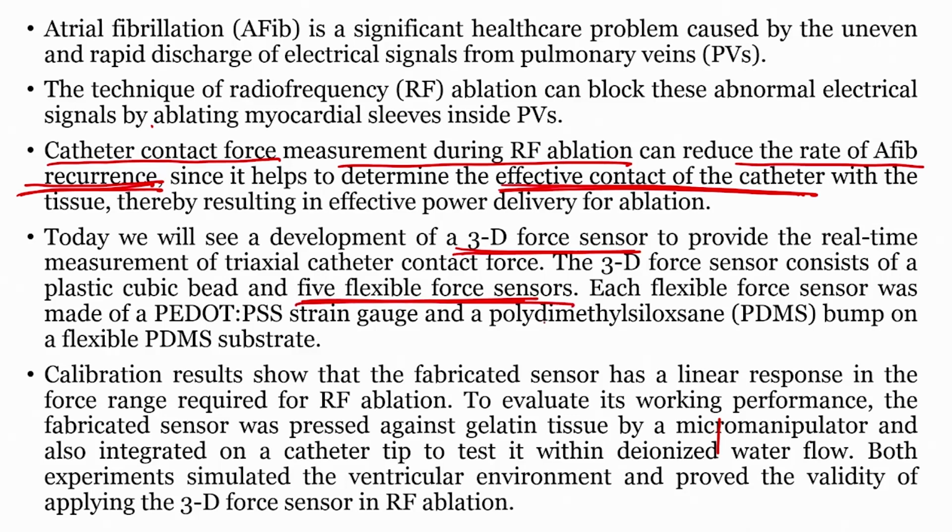We will discuss this in detail when we reach that particular slide, and how these force sensors are fabricated. These force sensors are fabricated with PEDOT:PSS, that is, we have patterned strain gauges using PEDOT:PSS, and there is a PDMS bump on the flexible PDMS substrate. We will see how it works. PDMS is nothing but polydimethylsiloxane.